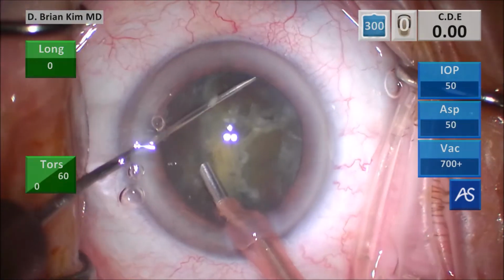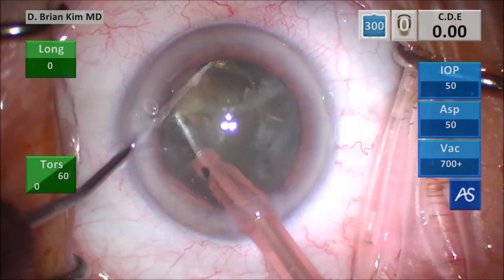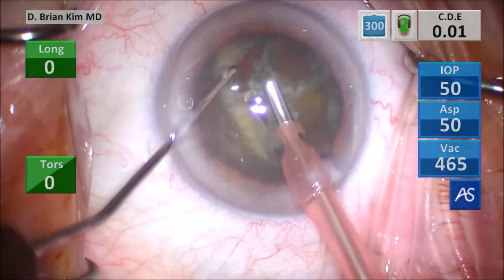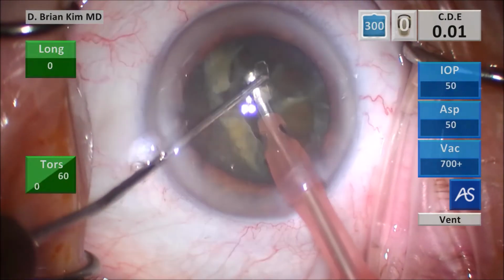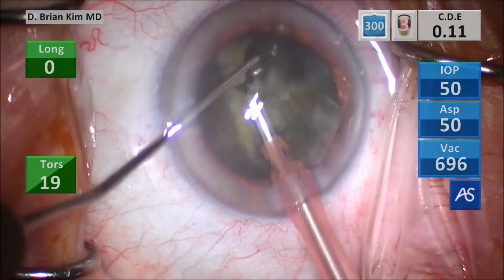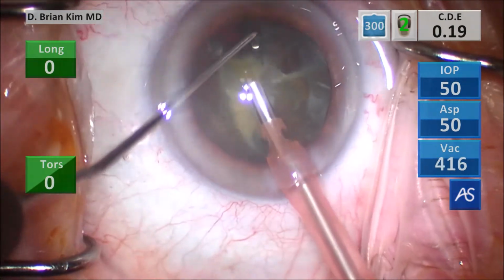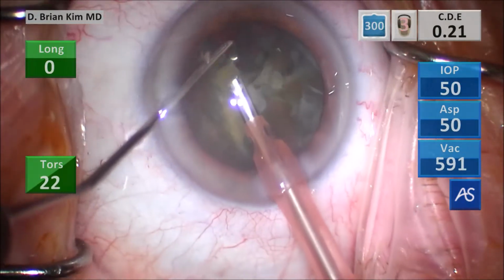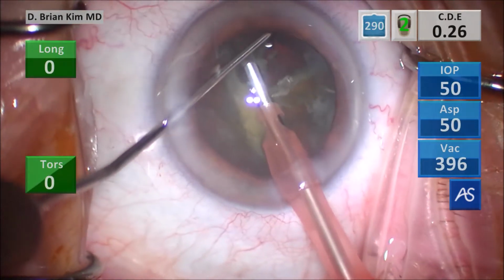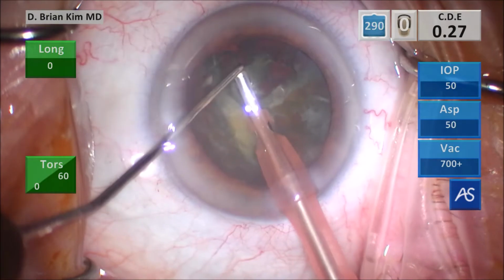Placing the chopper around that first quadrant, crushing it with the phaco tip, and then using successive crushing forces to break the lens into smaller pieces and emulsify those smaller pieces. Manipulating the lens piece with the chopper and then grabbing it with some vacuum and then emulsifying it.